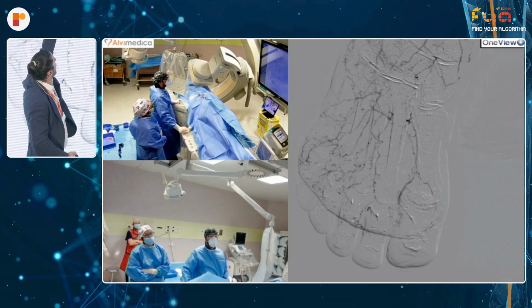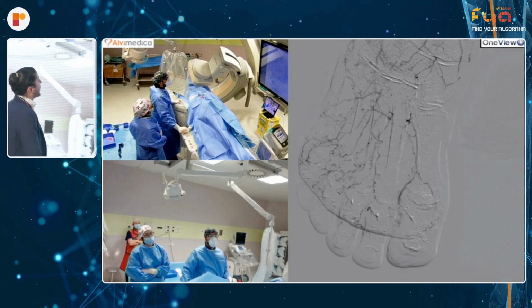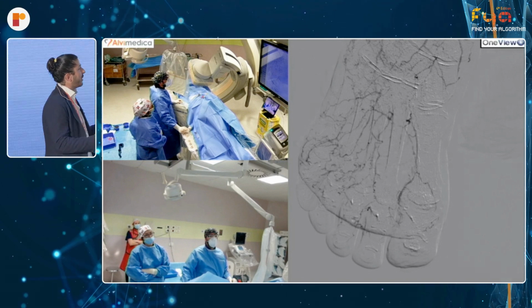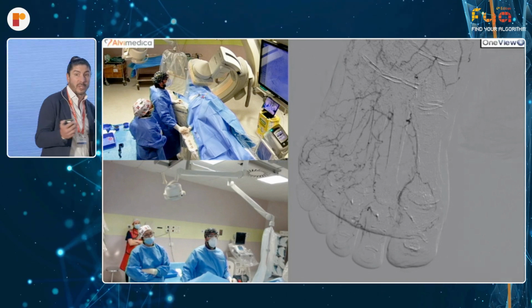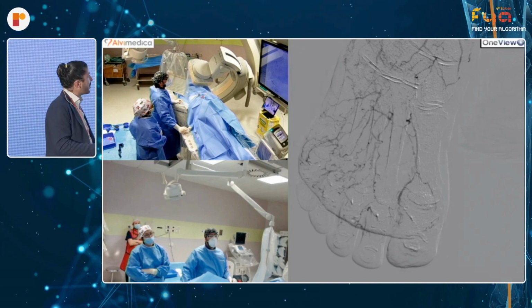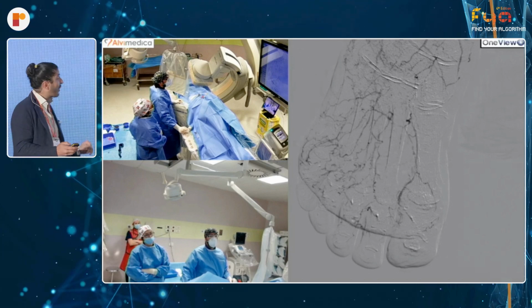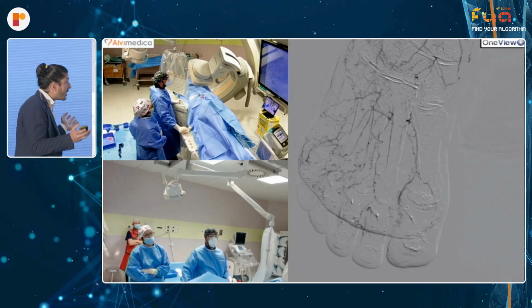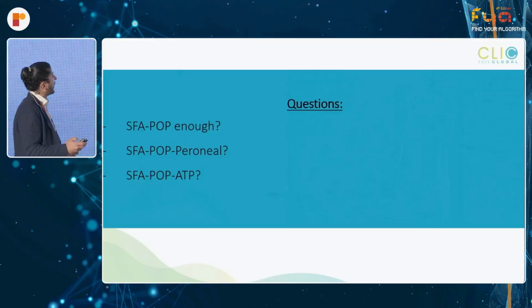First toe, a piece of the arch, no dorsalis pedis, no lateral plantar, so many collaterals. Considering the first anatomical variation we saw, so peroneal providing flow for the dorsal circulation, we can suspect some other anatomical variations. But honestly speaking, from the beginning, I didn't realize clearly how the anatomy was.